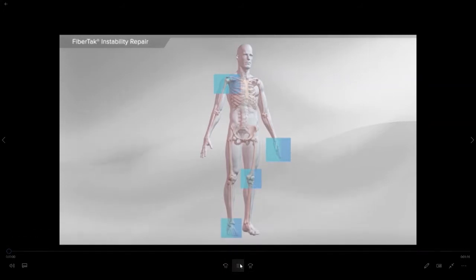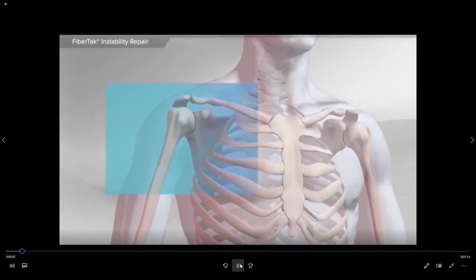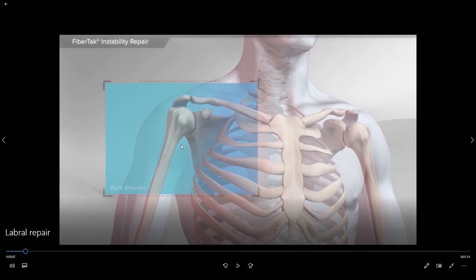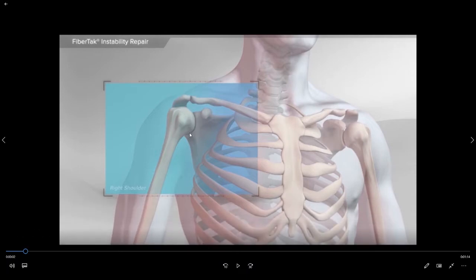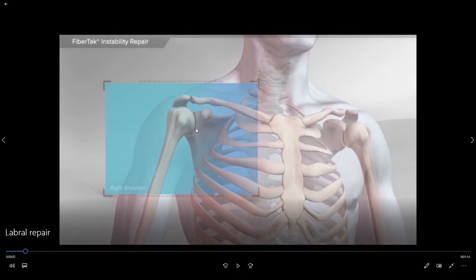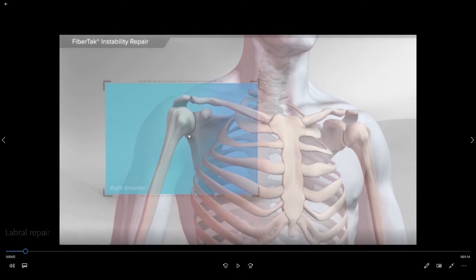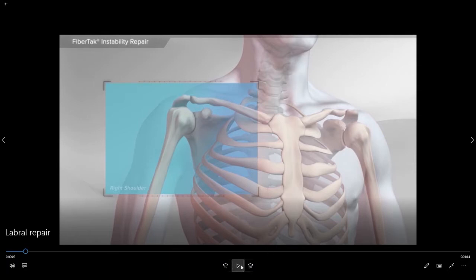We are going to start by looking at a right shoulder. If we look at the right shoulder, the shoulder is made up of a ball and the socket. As we discussed in the office previously, the labrum is a rim of cartilage that goes around the socket. So when we look at this surgery in our surgical animation, the computer is going to remove the ball so that all we see is the socket.